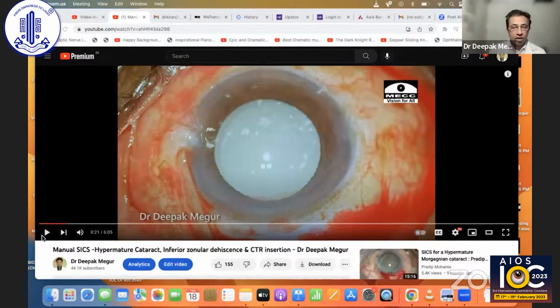I'll be speaking on the use of modifying your SICS techniques in cases of zonular dehiscence. So let me play the video for you now.